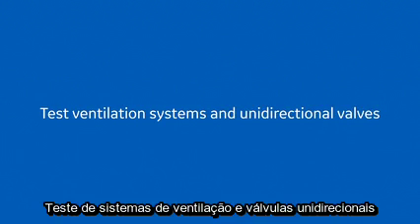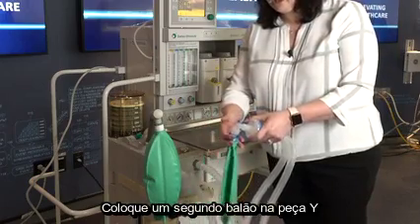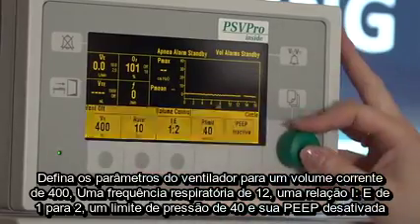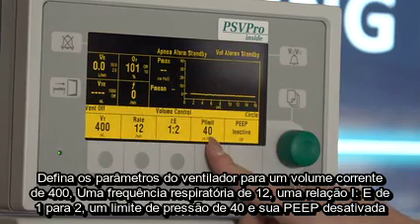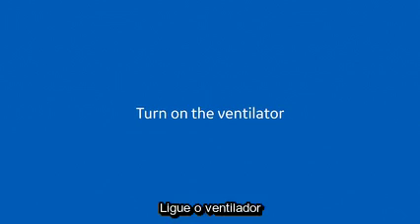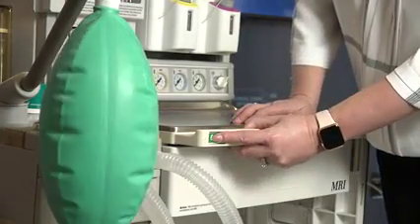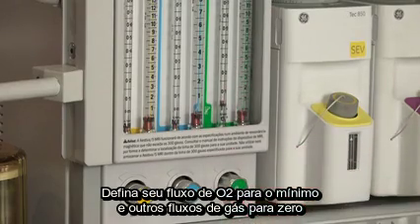Test ventilation systems and unidirectional valves. Place a second breathing bag on the Y piece. Set ventilator parameters to a tidal volume of 400, a respiratory rate of 12, an I:E ratio of 1 to 2, a pressure limit of 40, and PEEP to off. Turn on the ventilator. Move the bag-to-vent switch to the vent position. Fill the bellows and the breathing bag with O2. Set your O2 flow to minimum and other gas flows to zero.